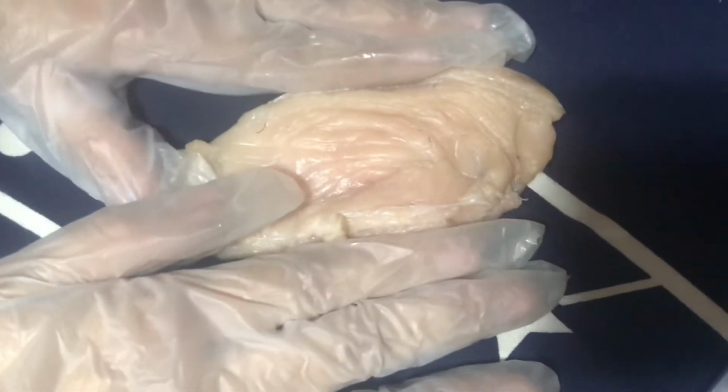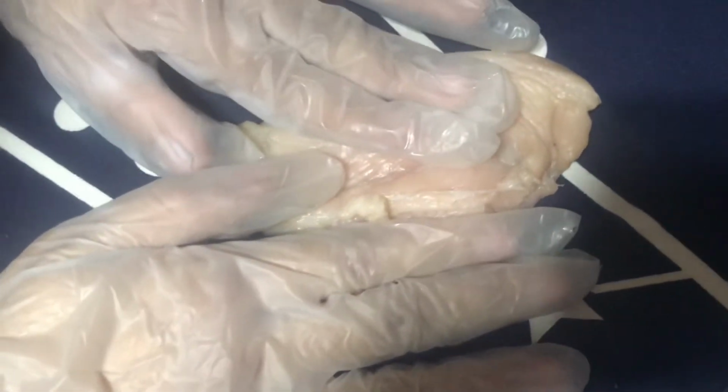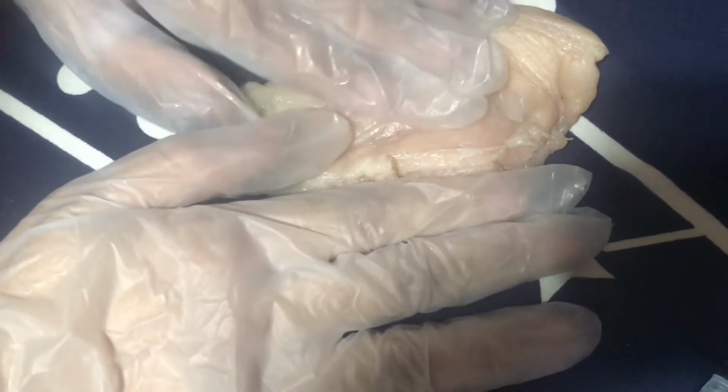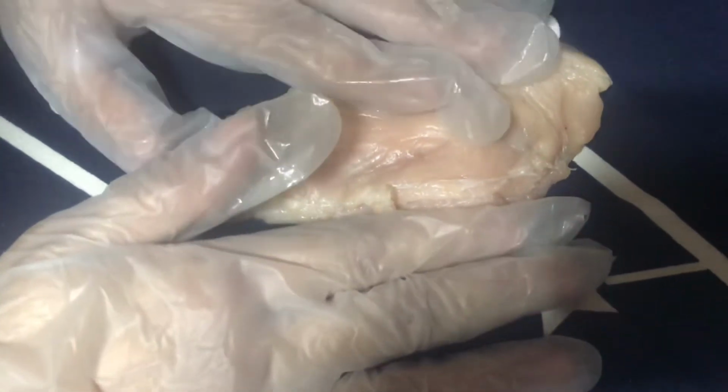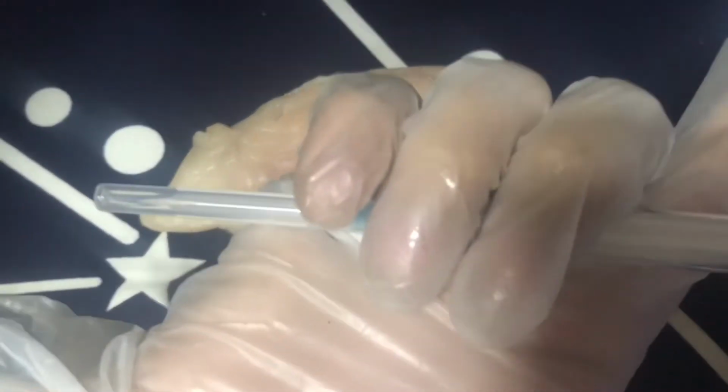So after disinfecting the injection site in a circular pattern from inner to outer part, hold the gauze between the third and fourth fingers of your non-dominant hand. Remove the needle cap by pulling it straight off. Hold the syringe with the thumb and the forefinger of your dominant hand as you are holding a dart.